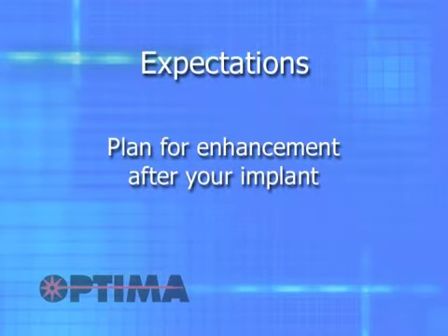So everyone going into this procedure must understand that in order to fine-tune the vision to achieve our visual goals, the probability is that we will need to perform a LASIK on one or both eyes in order to adjust the vision exactly to where we want it to be. And that's the same as LASIK or the phakic intraocular lens.